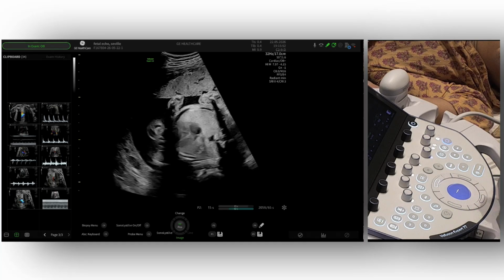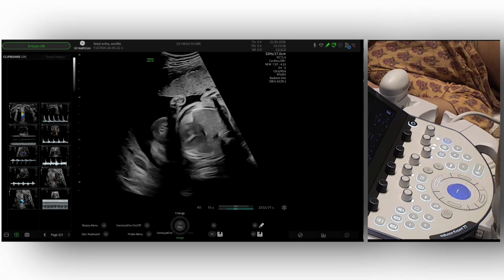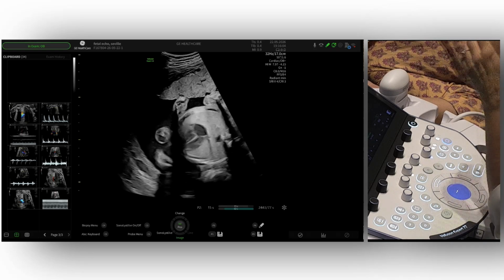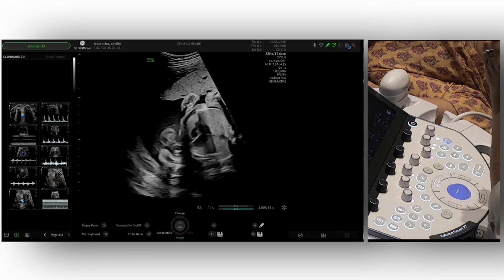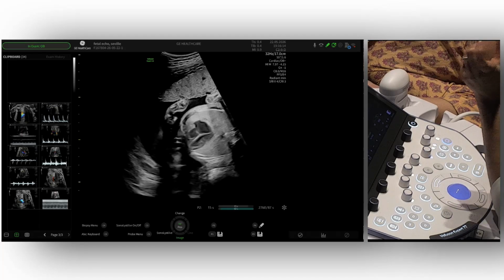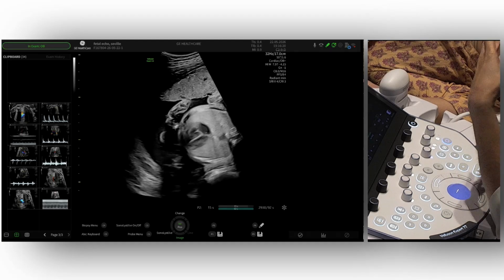It's true that when there is bradycardia, and the rhythm is slow, everything is easier because everything goes slowly and you can follow. In these cases, I usually do the mitral and the aorta because to me it's very easy and fast to do. But when there is tachycardia, sometimes the inflow of the mitral gets fused, and instead of having the two waves, you have one, and everything goes very fast, and then you get lost.